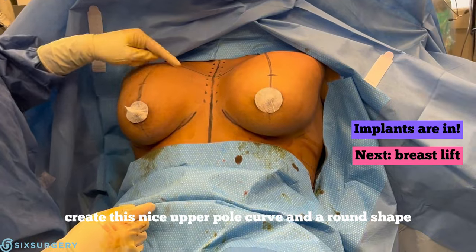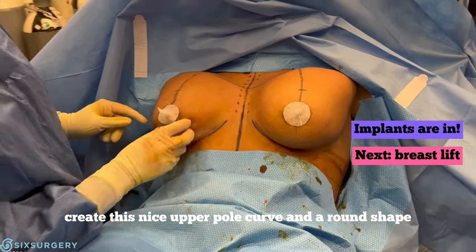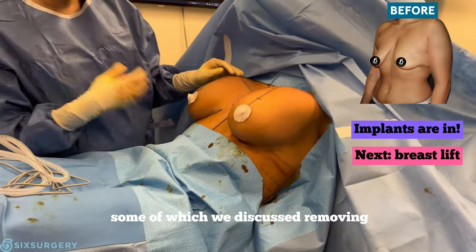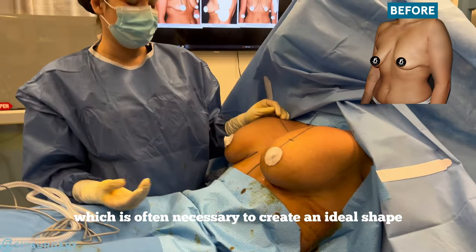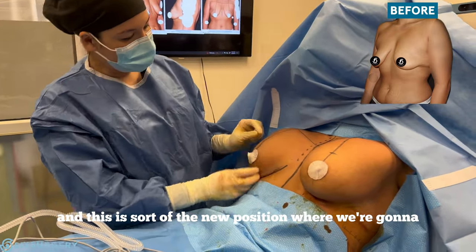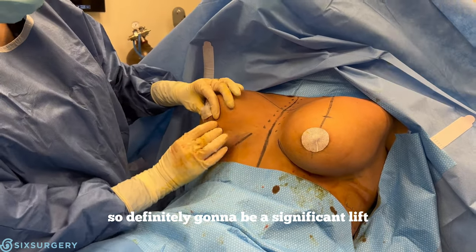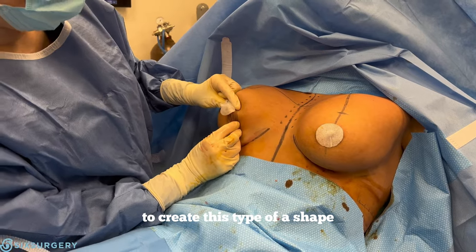Now we have the implants in. As you can see, it creates a nice upper pole curve and a round shape, but it doesn't quite have the right shape yet. She has a lot of natural breast tissue, some of which we discussed removing, which is often necessary to create an ideal shape. This is the new position where we're going to place her nipples — it's definitely going to be a significant lift to create this type of shape.